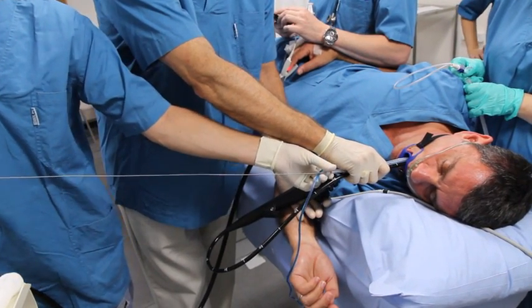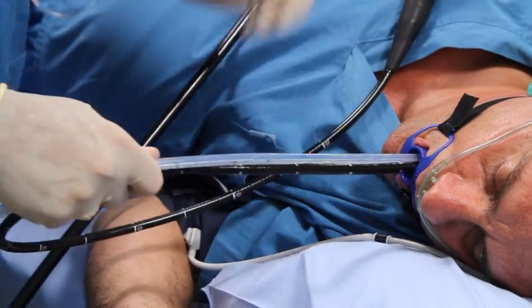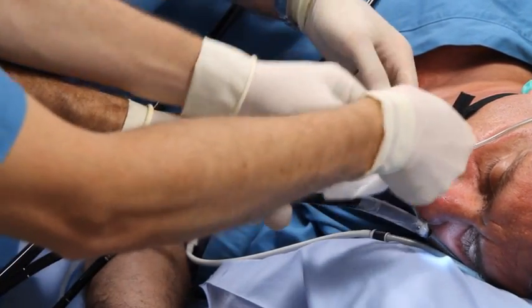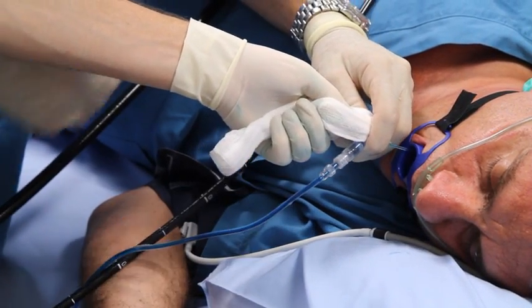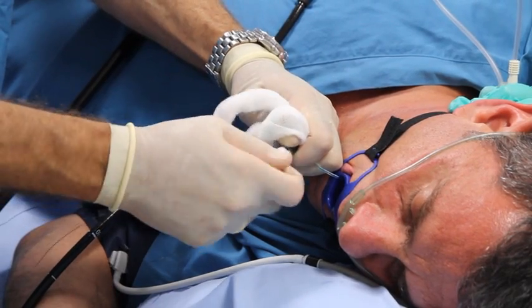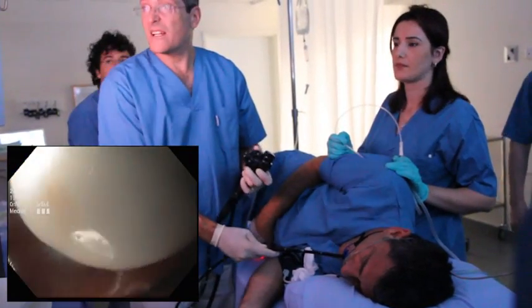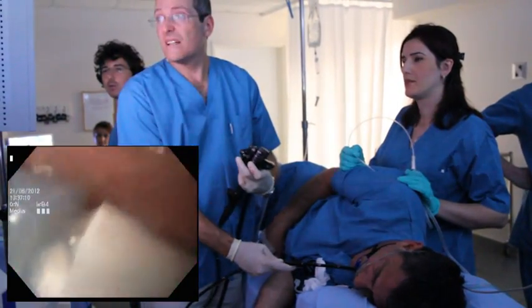Remove the guide wire. The endoscope and pusher are removed together until the valve exits the mouth. The valve is secured by the assistant while the extension tube is disconnected and replaced with the white cap. Lower the valve into the back of the throat. Reinsert the endoscope and gently push the white cap and white catheter below the GE junction. The procedure is now complete.